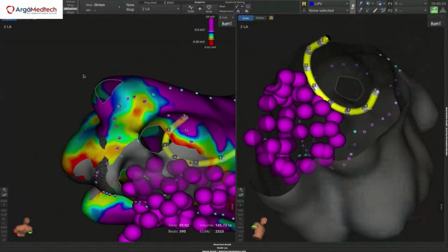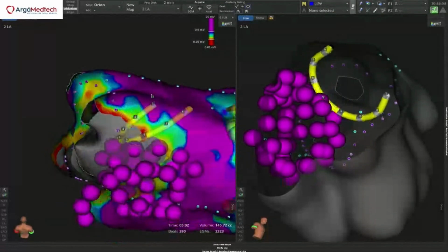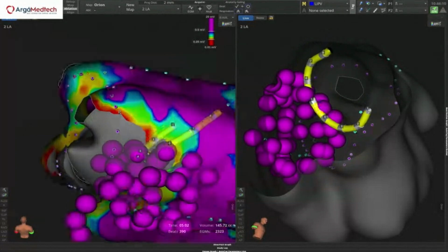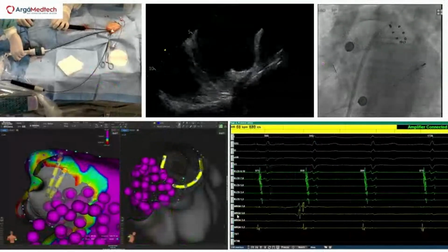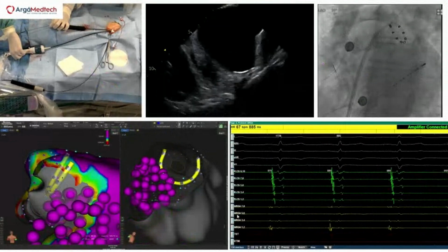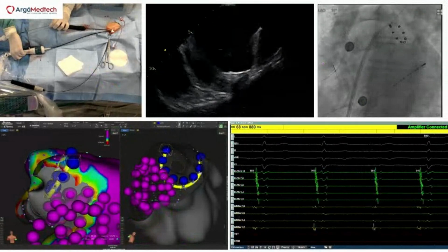You can see that the left posterior wall is spared by the ablation currently, but the plan is also to perform posterior wall isolation as well. Okay, so we are ready to take off. We have performed the right-sided veins and the left inferior vein, we remapped, and then we're ready. We have the circular catheter inside, you see it on fluoro, an 8-electrode circular catheter. Now we drive our catheter to the left superior, and I will annotate which segments I'm ablating. This is left superior, watching from the inside: anterior, posterior, and inferior for the left superior. You see the signals on the circular catheter, signals are still there, so the vein hasn't been isolated. This is LSPV, pulse 1, go.